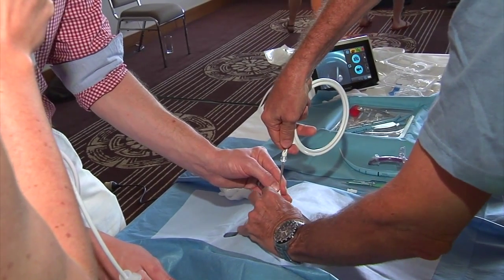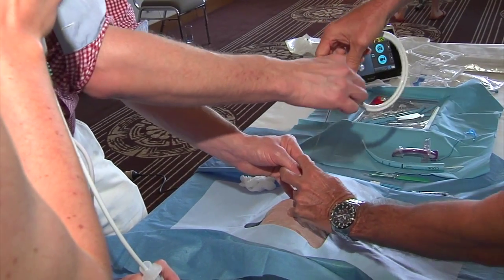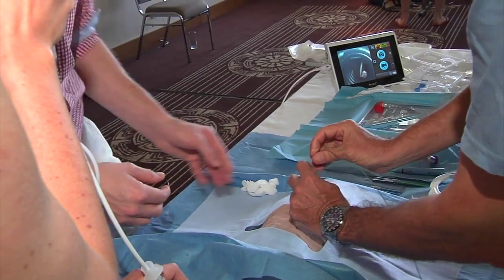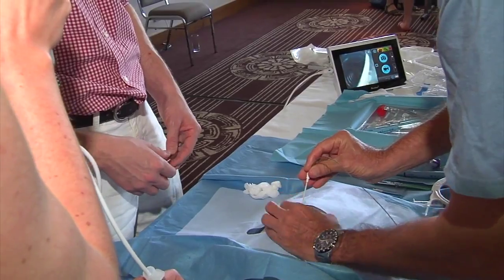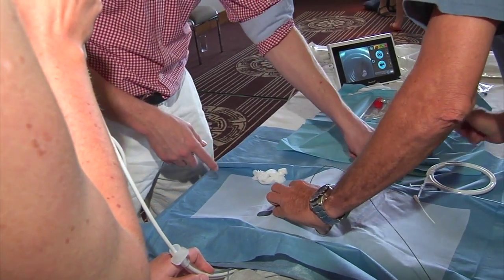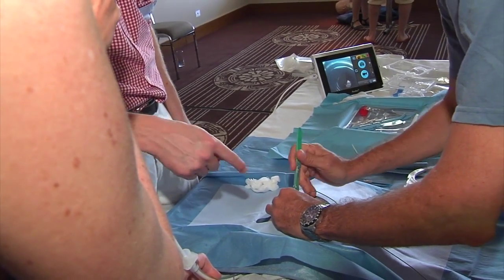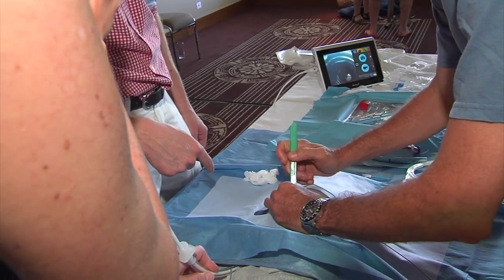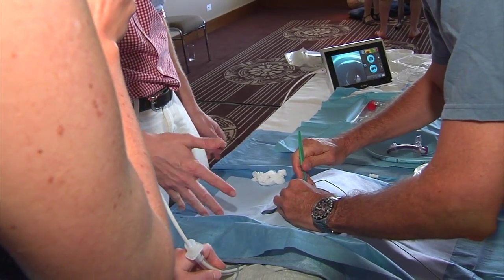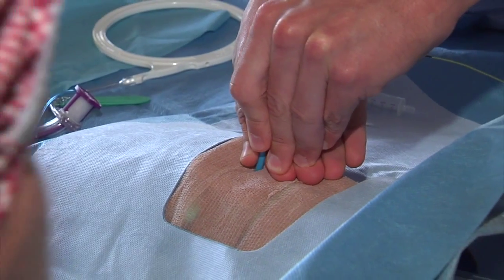That's all you need to do there — take the whole housing off the guide wire, take the cannula out, and leave the guide wire in. Now the knife — incision about one centimetre up and one centimetre down. I normally do it vertically. Looking at the slickest procedure list of the day here.